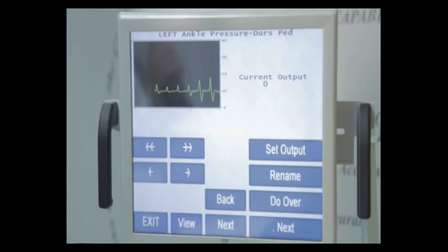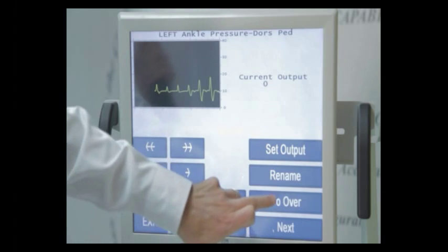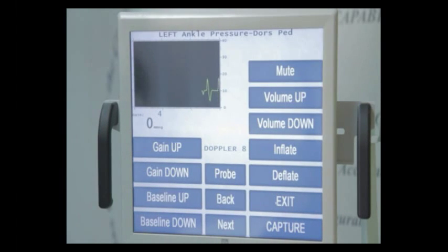If at any time you think you might have slipped off the vessel, simply hit capture. That will freeze the screen. Press do over, and that will bring up a new fresh screen.